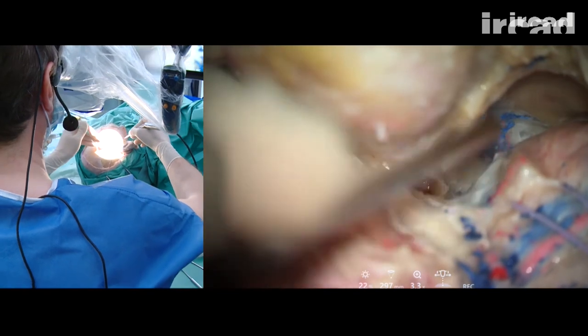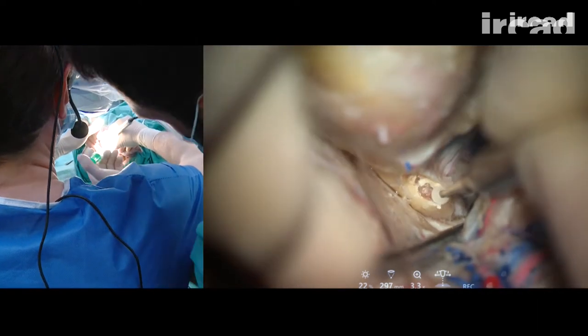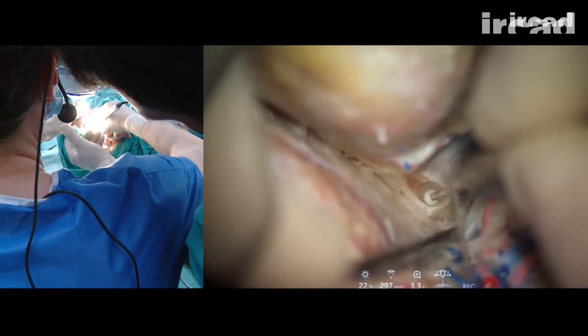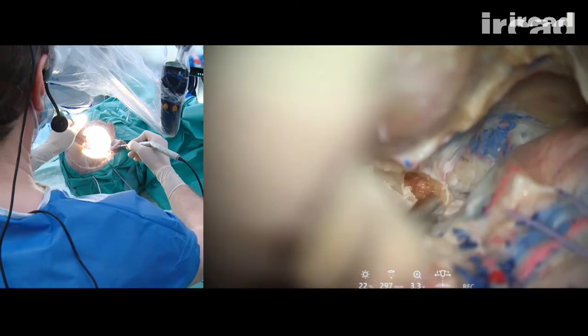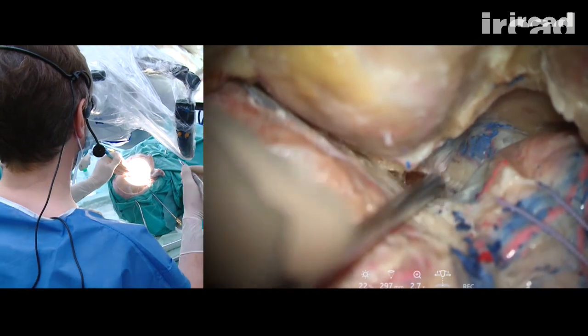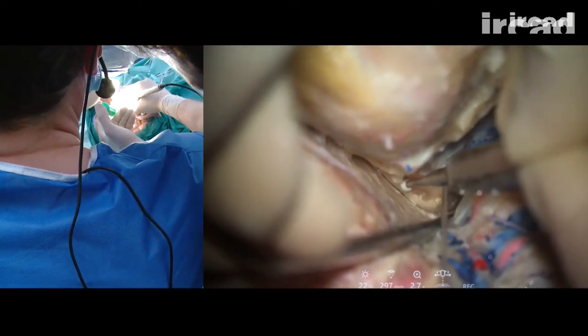Okay, here is the cancellous bone of the clinoid process, and I want to enlarge the base to really be able to empty the clinoid process from this cancellous bone, from the center to the periphery of the clinoid. If I am in the cancellous bone, I am quite safe. Whenever I have cortical bone, I slow down and I am more careful.